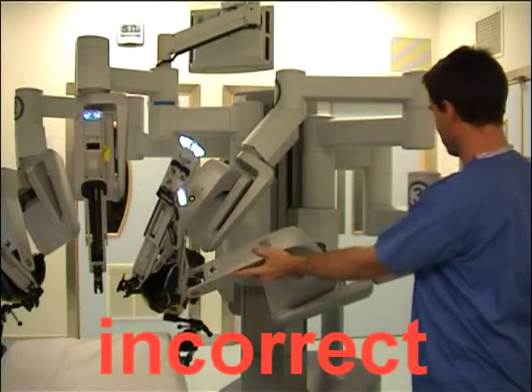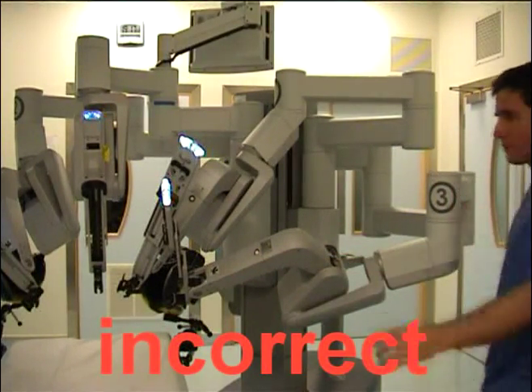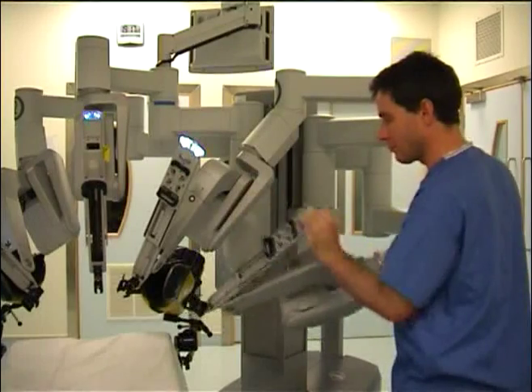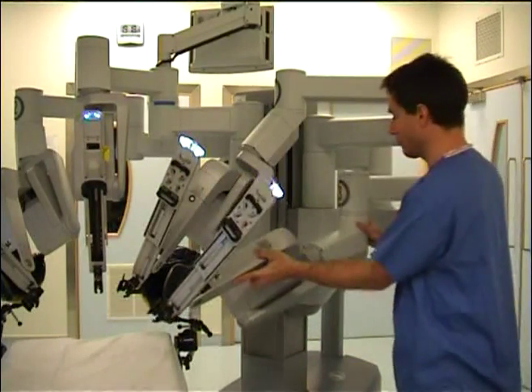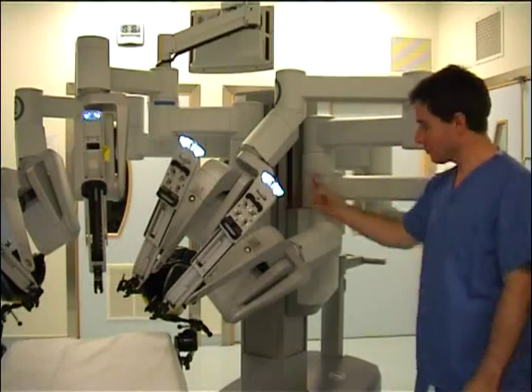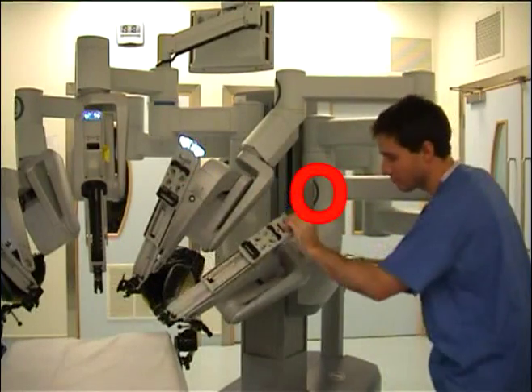Having clipped on arm 1 and 3 to the trocars, it is then important to position the arms correctly to allow sufficient range of movement. We will demonstrate the position of arm 3, but the same applies to arm 1. If the arm is not pushed towards the central column, there is a limited range of movement. If the arms are pushed towards the central column, the range of movement is increased. Note the number 1 and 3 are facing to the left lateral as per arm 2.